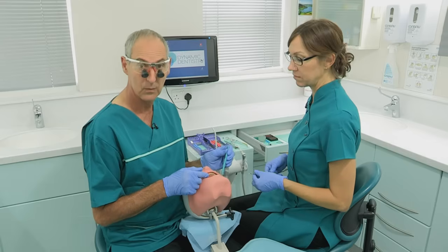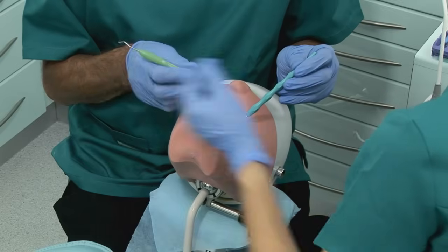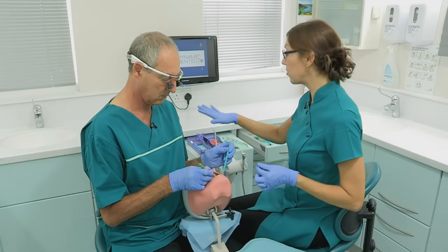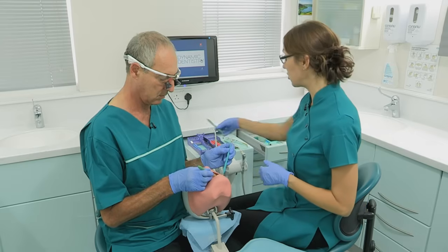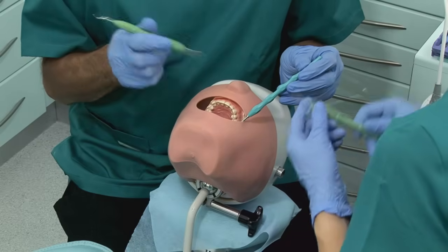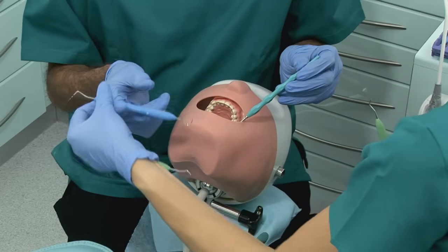So we've done our cavity, we've done all the drilling that we need to. Now I just need to check the cavity really with an excavator or a probe. So Sally's going to pass me the instruments. Now, to make this a viable procedure to do, the nurse will need to have the instruments at arm's reach. So somewhere, a work surface will need to be made available so that you can place the instruments so that they're easy to pick up and pass across. So these are double-sided instruments, which I just flick around if I need it. And if I want to probe, just to have a look. Thank you.